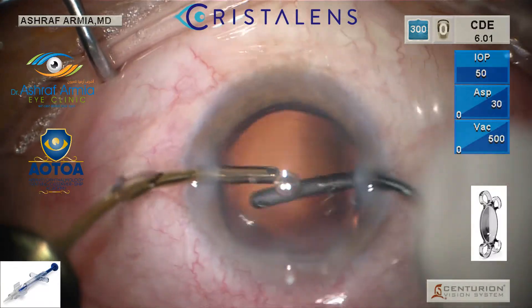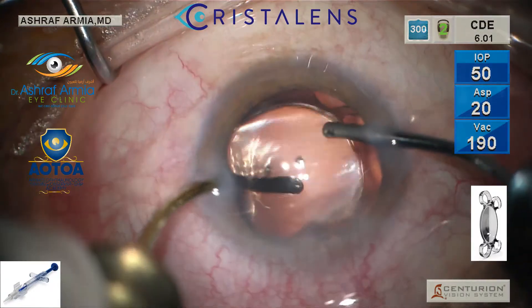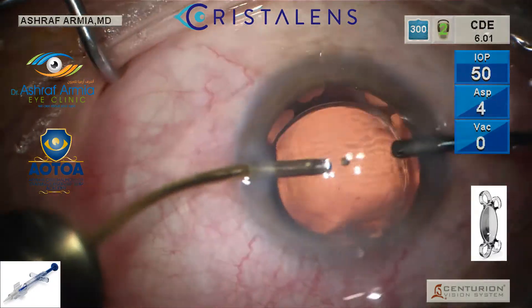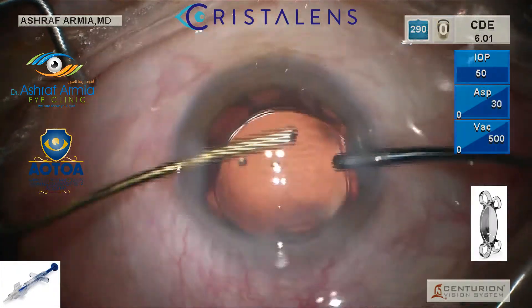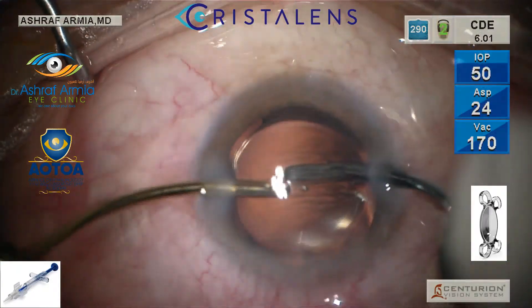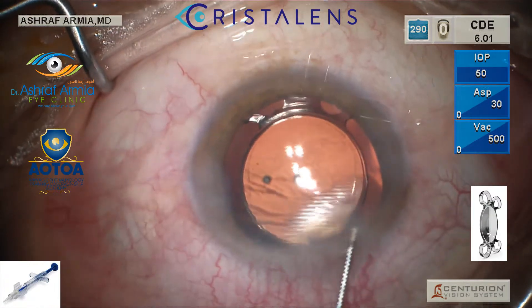Make sure to achieve a close and tight junction between the lens and the posterior capsule to decrease PCO. It is a rounded-edges IOL, so it makes the adhesion between the IOL and the posterior capsule very nice.